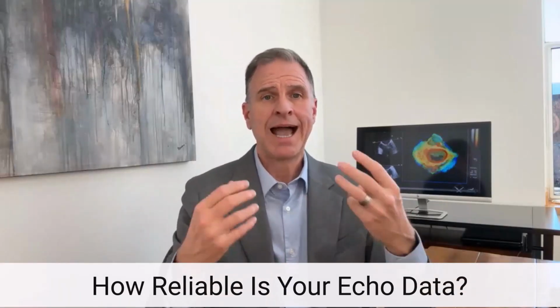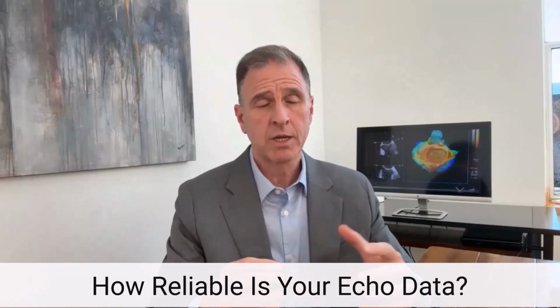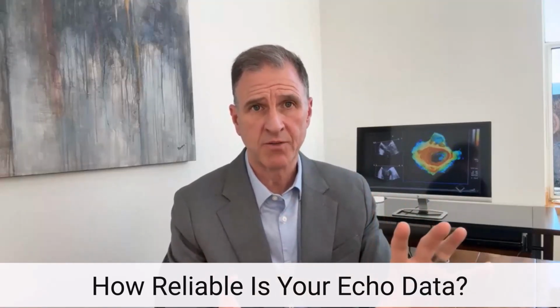The last element is how confident are you going to be in the data that you acquired? Well, if you went over all these different aspects we discussed in the pitfalls, maybe at the end of the road, the data that you're looking at might look like a low flow, low gradient aortic stenosis, but maybe it could be explained by the way the system processes the information that's presented to it through the transducer.